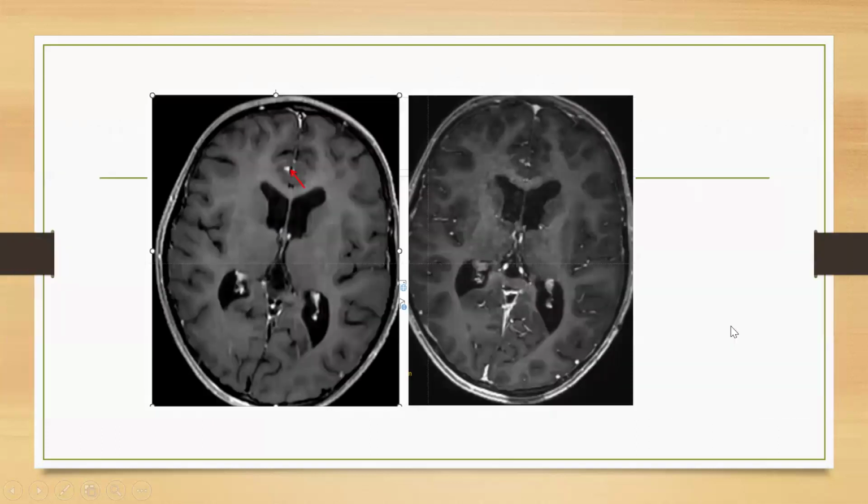And also when doing the imaging, many other centers still use the gradient type of imaging, that is SPGR type of imaging, but it's better to use the 3D T1 spin echo black blood imaging. This is because we are able to pick up even 1 mm, 2 mm lesions with black blood imaging. The vessels will be suppressed, only the tiny nodular lesions will be picked up.